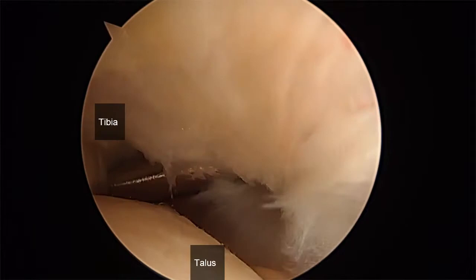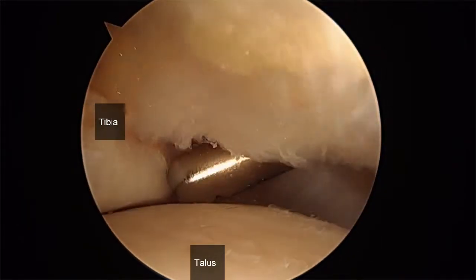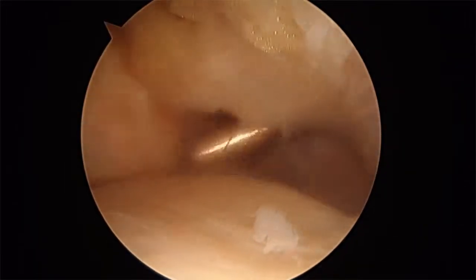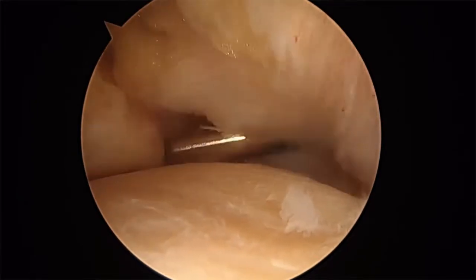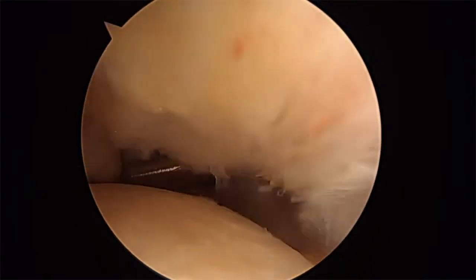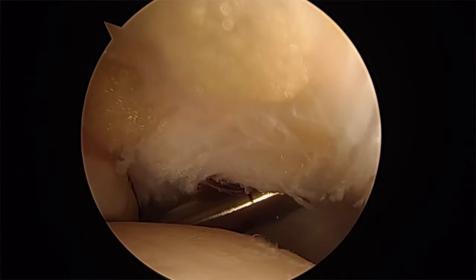This is the anterolateral gutter. I'm going in right now, going after the anterolateral space. Going in toward the fibula. That's the syndesmosis we're looking at. Go in the gutter.